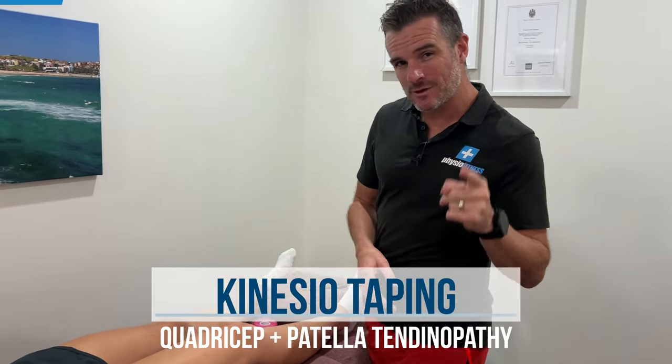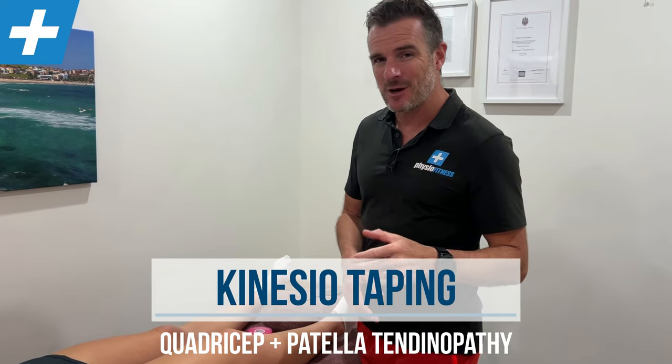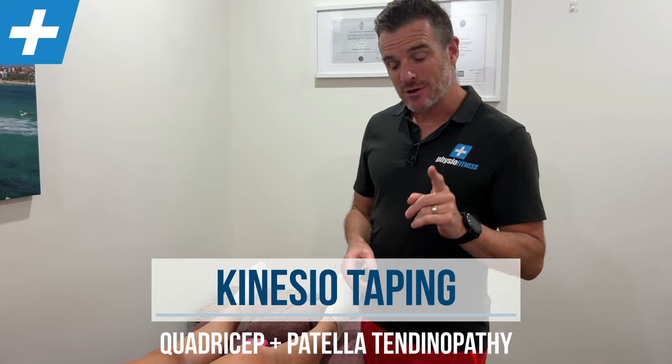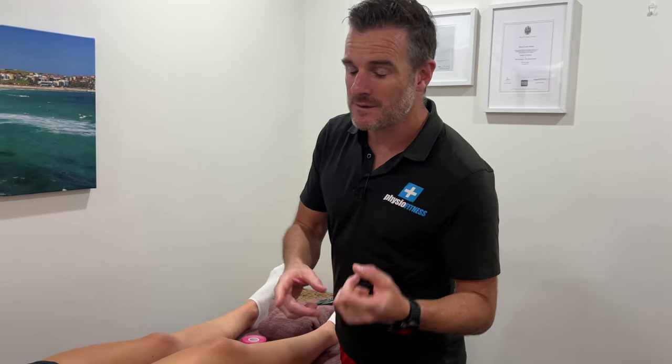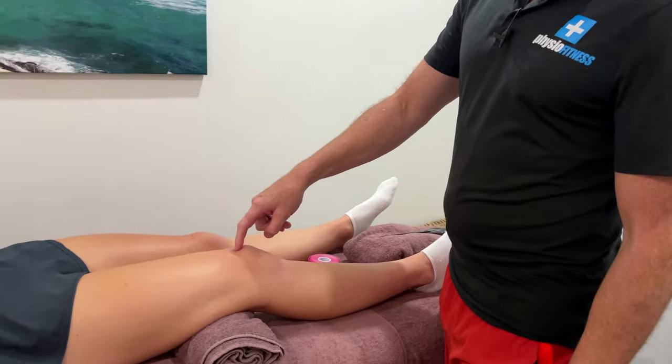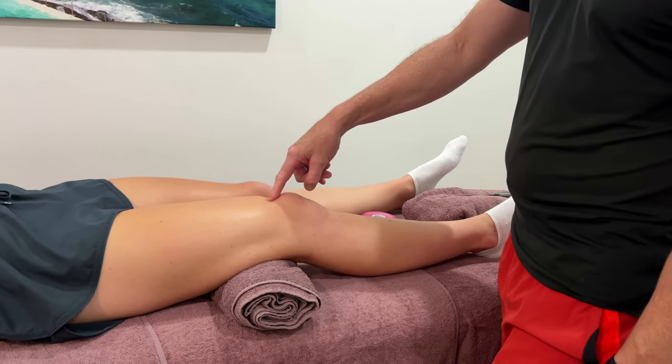Today's taping is for patella or quadriceps tendinopathy to help reduce the pain so you can train and strengthen it up. I'm going to show you the taping we use for both — there'll be slight modifications whether you have patella or quadriceps tendinopathy. Remember: patella tendon is below the knee, quadriceps tendon is above the kneecap.